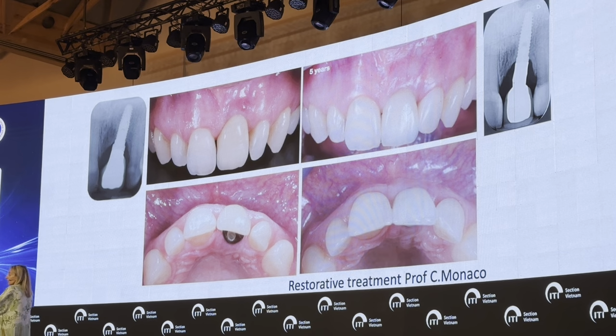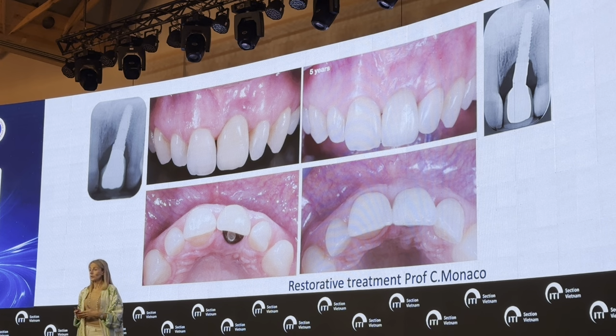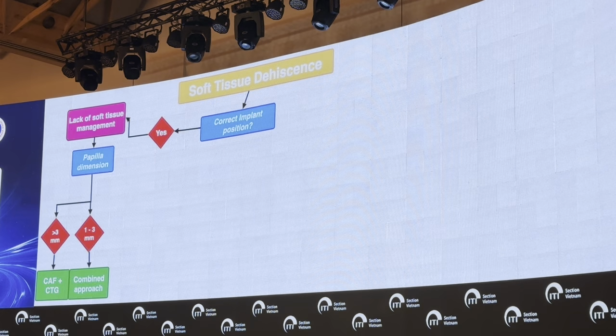at least. Then the prosthodontist can start the second prosthetic phase, which is called the conditioning phase, in which he or she starts to recreate the right scalloping of the margin of the soft tissue, and at the same time guides the interproximal tissues to grow in a coronal position. And so this was the final result, and this was one of the cases that was part of an article.